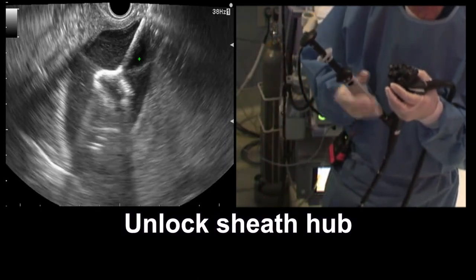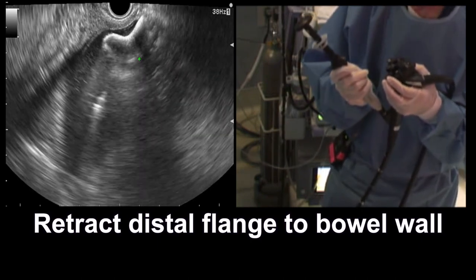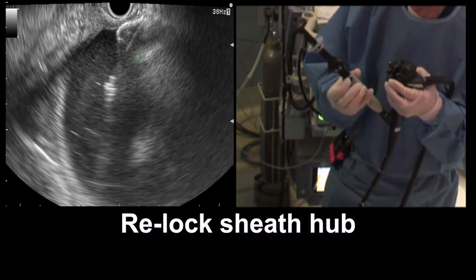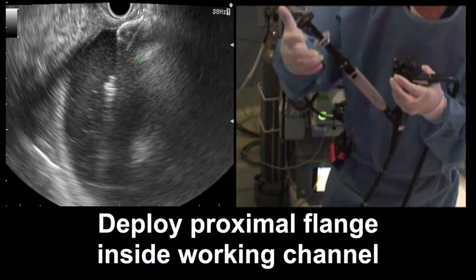We're going to unlock the sheath now and pull back the sheath, snugging the distal flange up against the wall of the cyst. We're now going to relock the sheath and deploy the proximal flange.